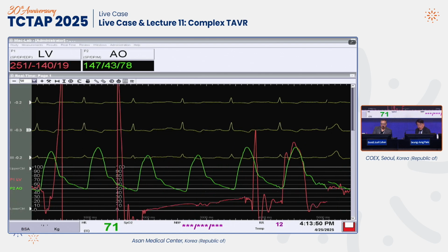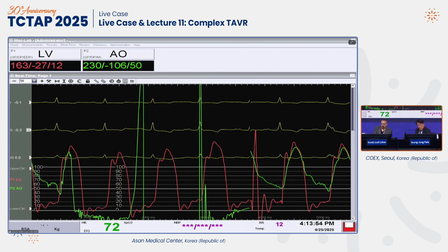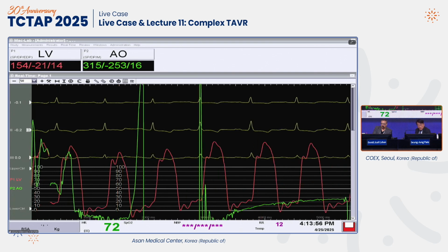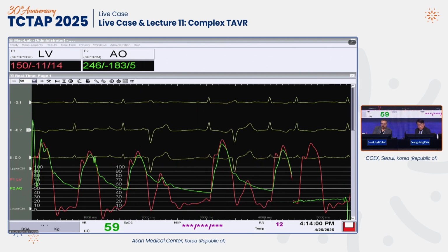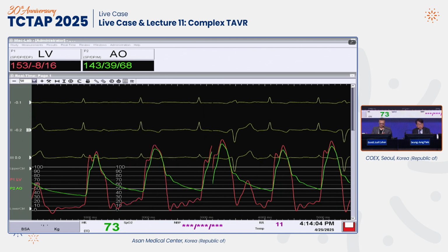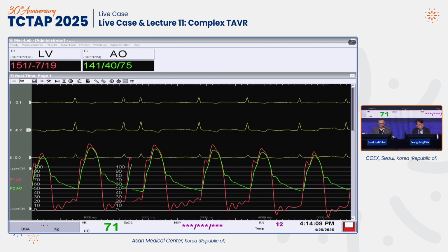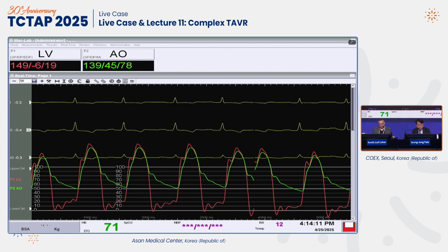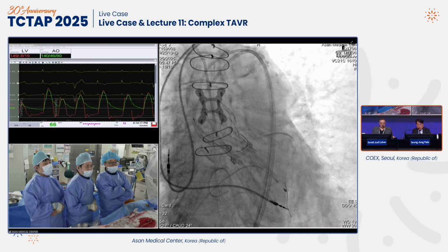Another side. Let's see. Okay, now turn on the pressure. So, and this is hemo. Okay, wait, did it go in? Here, LVJ. Okay, so I think hemodynamics is good, and there is still some pressure gradient. I think it's good. Less than 10.